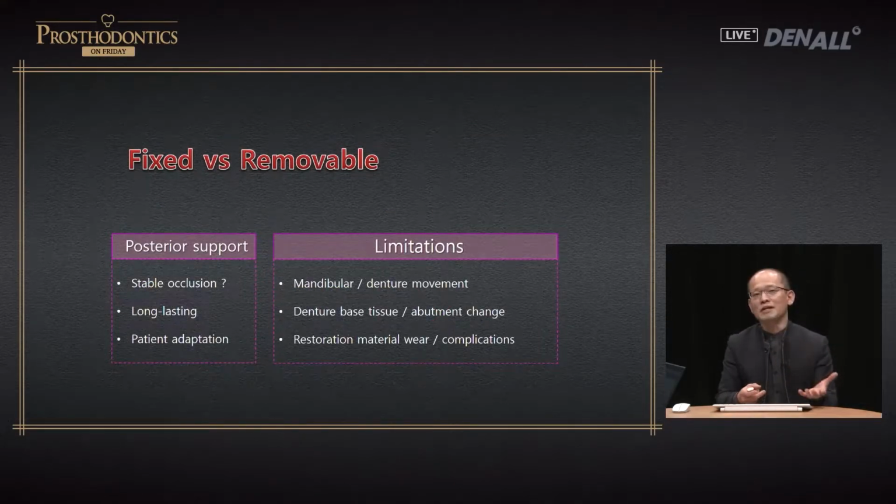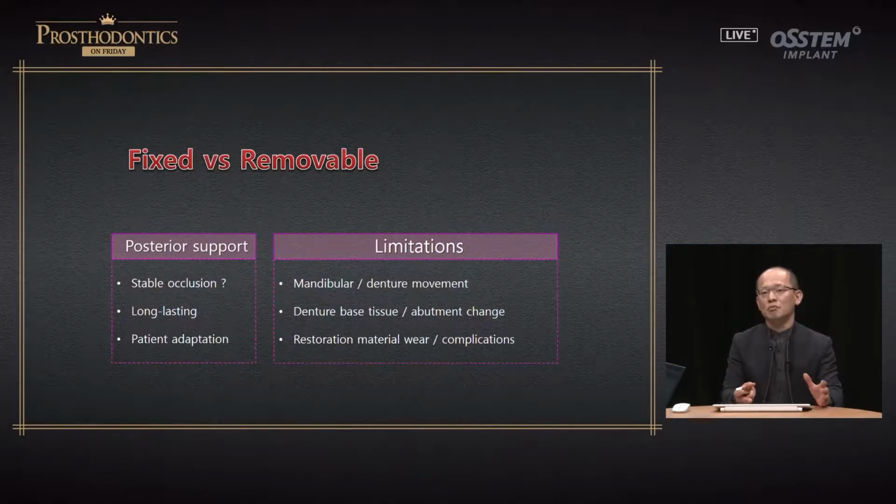In terms of how you do rehabilitation, are you going to use fixed or removable? Using implants for the full arch, you could do fixed or removable, but the prognosis will be different, and also cost-wise.